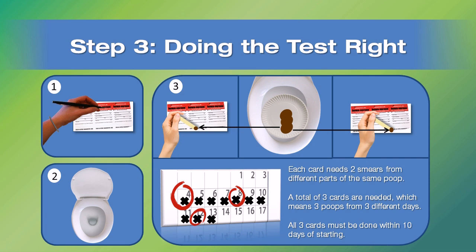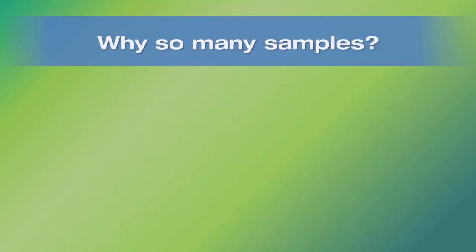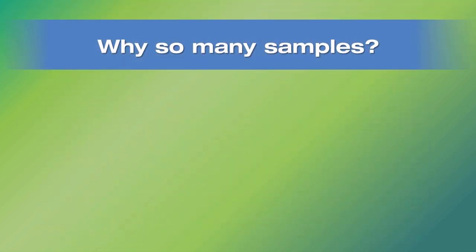Repeat this for 2 more days, making sure you write the name and date on your sample. Complete this within a 10-day time frame. It doesn't have to be days in a row, it just has to be within the 10-day period. Some people wonder, why is this test so complicated? Why so many samples? Here's the answer.